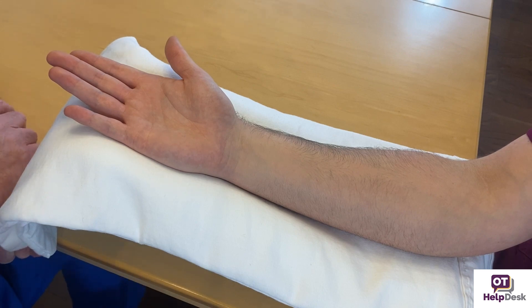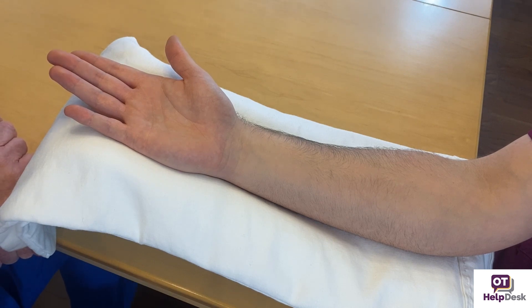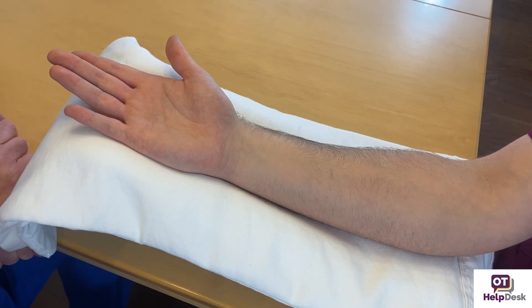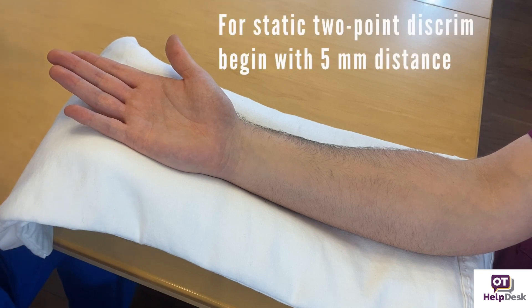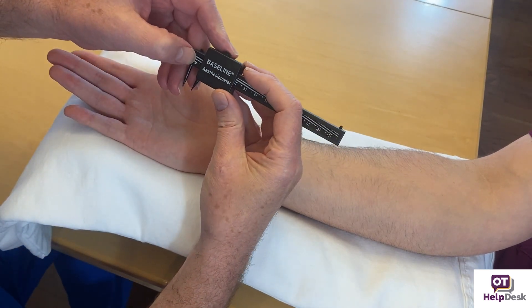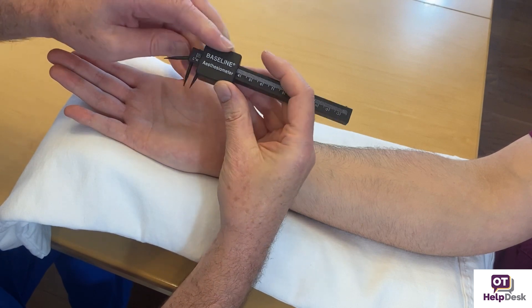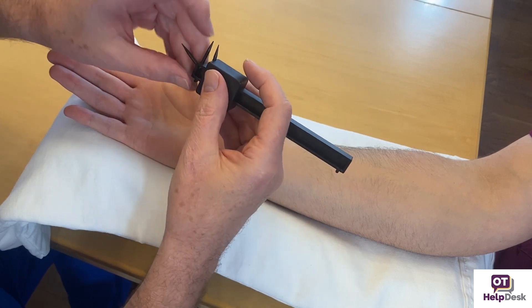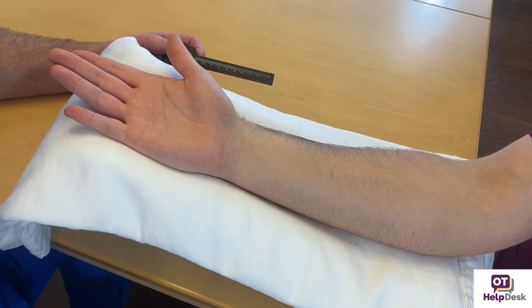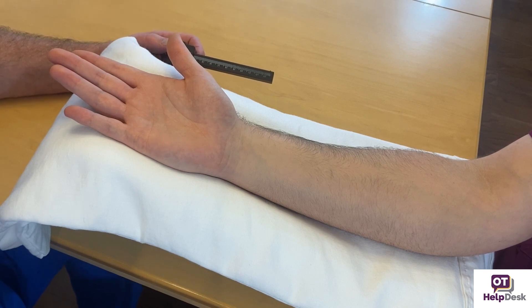For the procedure of two-point discrimination, we test only the fingertip, as it's the primary area used to explore touch. We begin with a distance of five millimeters — so one, two, three, four, five — that's about the distance right there. Remember that five millimeters is the distance they would test you on between the points.